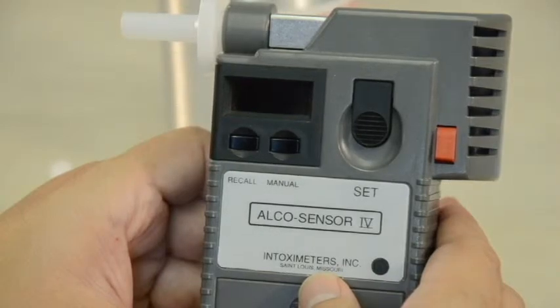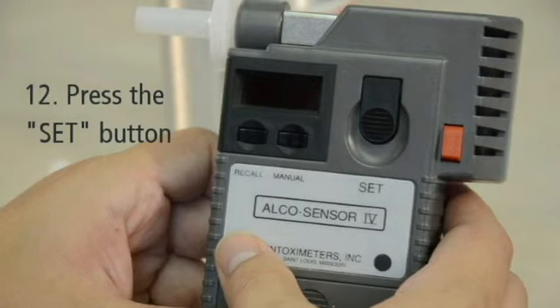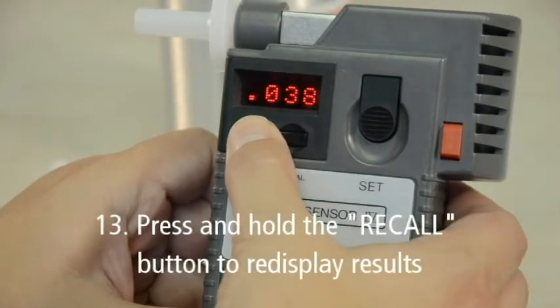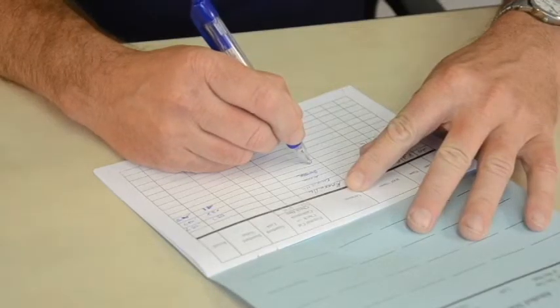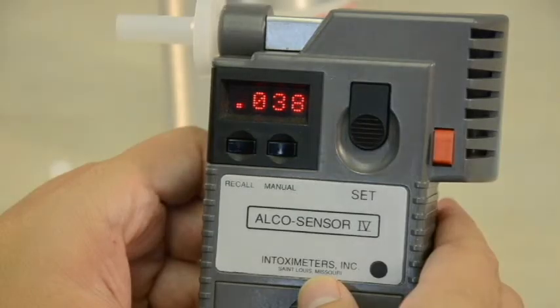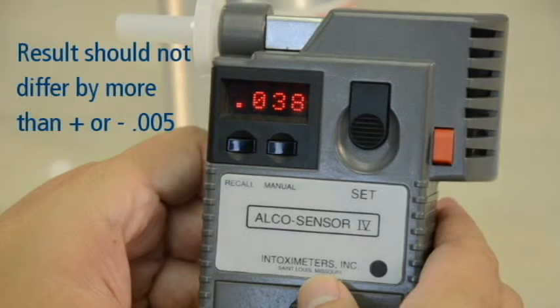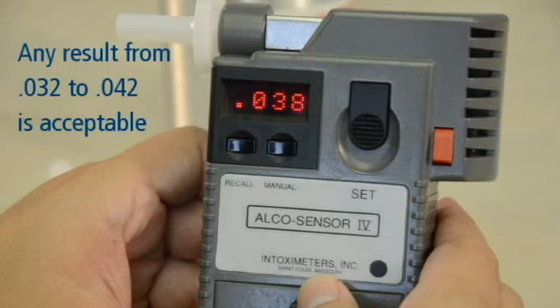When the instrument flashes SET, press the SET button. This ensures the fuel cell sampling chamber is in a closed position and the device is ready for the next test. After pressing the SET button, you may press and hold the RECALL button to re-display the accuracy check result. Record the accuracy check result in your logbook. Remember, the results of your accuracy check must be within plus or minus .005 of the expected known value. From our earlier example of an expected value of .037, any result from .032 to .042 is acceptable.